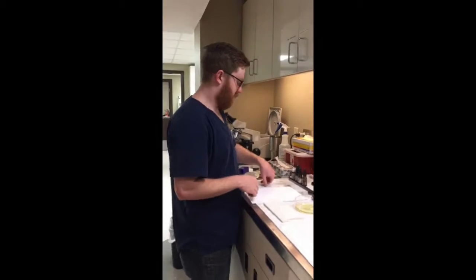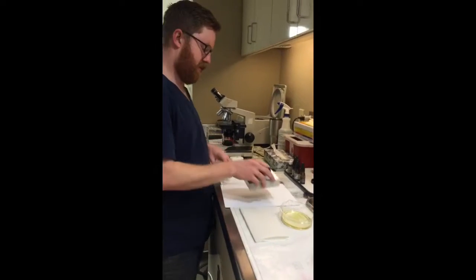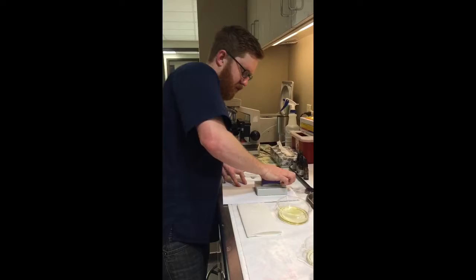I'm David Molinax, and I'm going to be demonstrating how to perform a complete urinalysis. First thing I'm going to do is come over here and make a stamp that kind of guides us through the entire process.